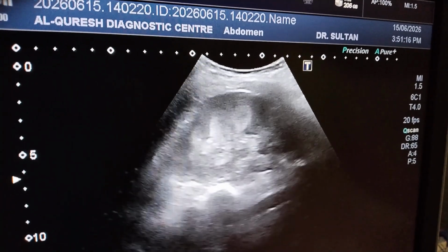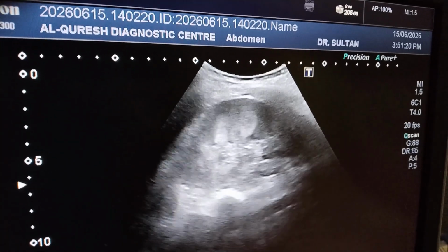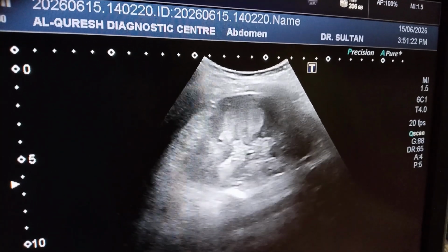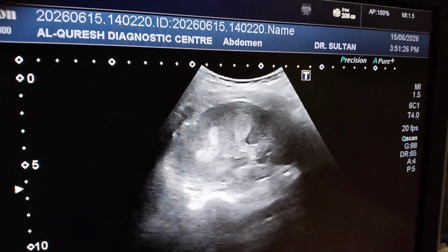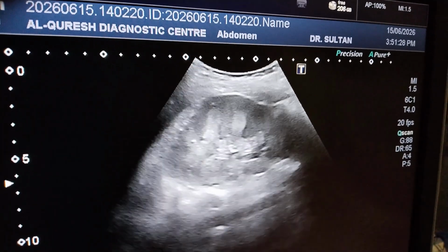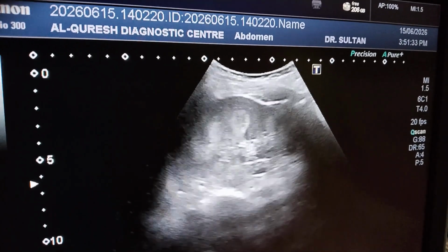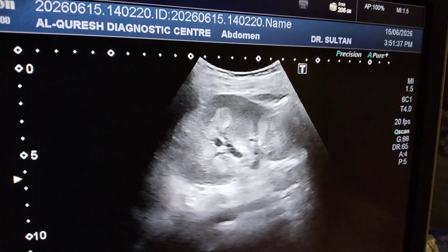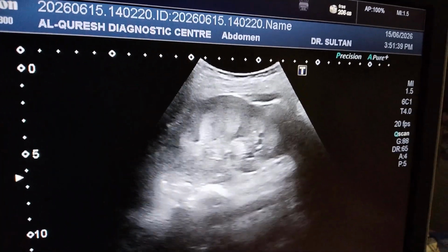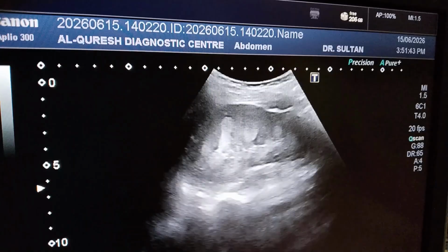Most common causes in this age group are renal tubular acidosis, जो distal tubules होती हैं उसकी acidosis हो सकती है अर्ली और या फिर इस एज में तो मुश्किल है कि हाइपरपैराथायरॉयडिज्म हो, मुश्किल है. विटामिन डी भी कॉज करती है या बायलैटरल मेडुलरी स्पॉन्ज किडनीज भी कॉमन कॉज हैं मेडुलरी नेफ्रोकैल्सिनोसिस की.